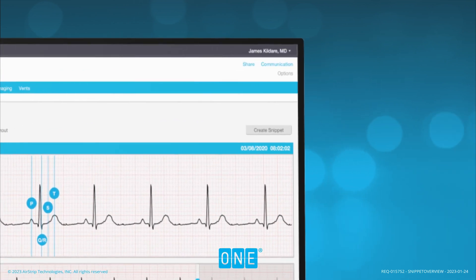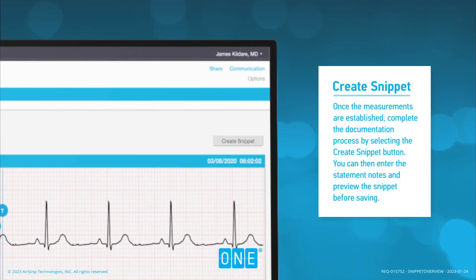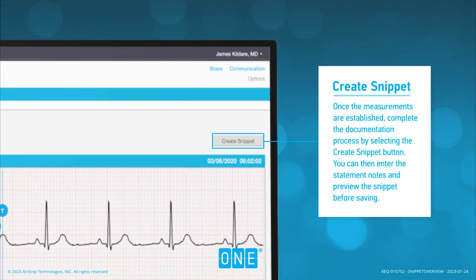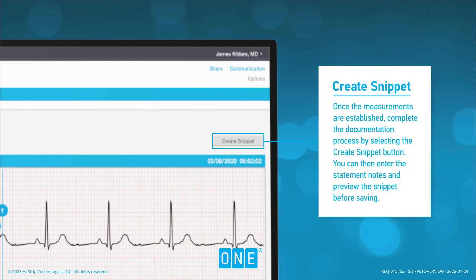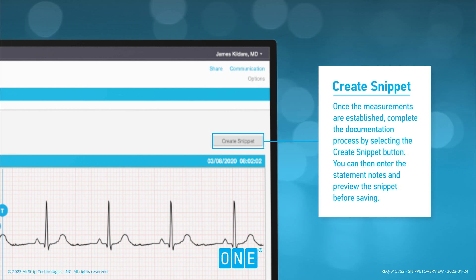Create Snippet: once the measurements are established, complete the documentation process by selecting the Create Snippet button. You can then enter the statement notes and preview the snippet before saving.